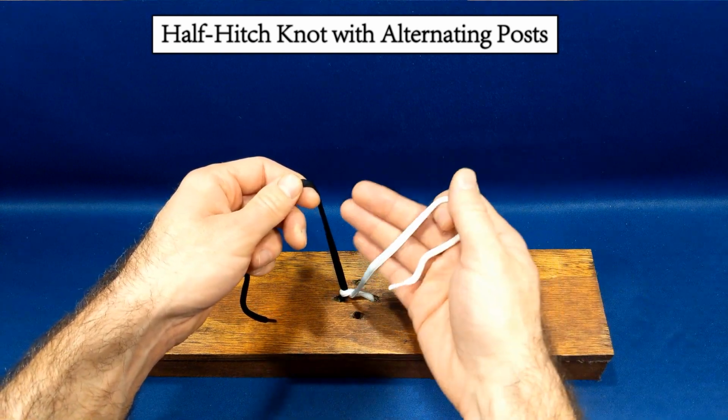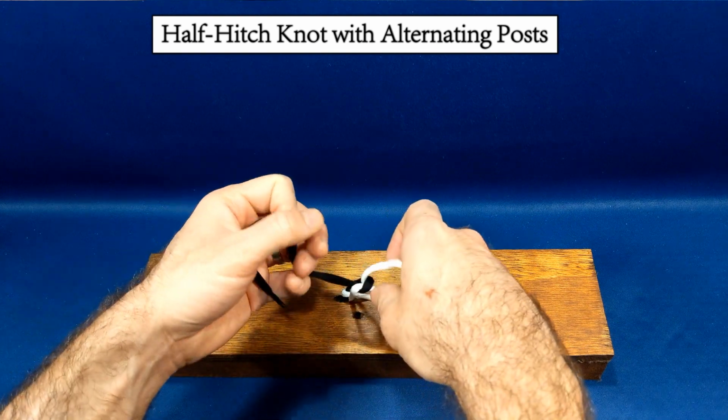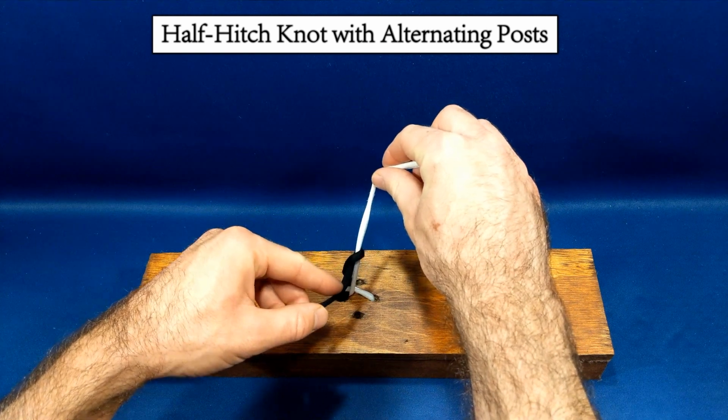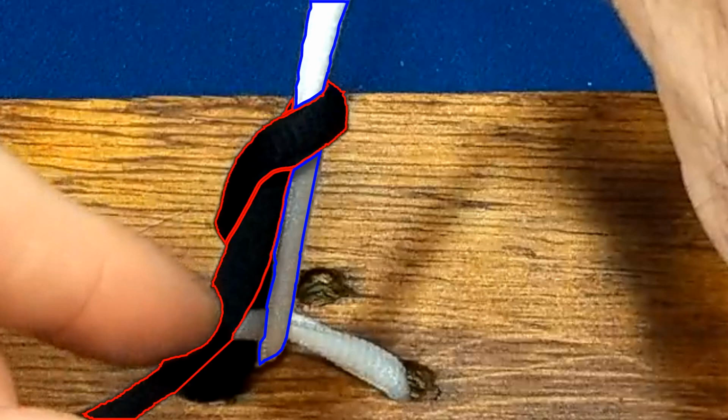Then an underhand throw is performed, but this second throw is tightened instead using the white strand held by the right hand as a post, with the left hand pushing the black strand down to the wooden board. If we take a closer look, we can see that for this second throw, the white strand, highlighted in blue, passes as a straight line or post through the throw, and the black strand, highlighted in red, wraps around it.